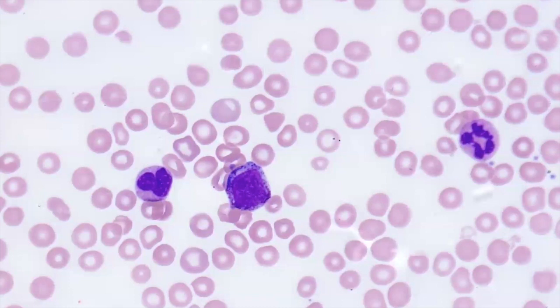On bone marrow biopsy, the finding of clusters or sheets of megakaryocytes with significant fibrosis and/or marked granulocytic dysplasia may be considered suggestive of an accelerated phase CML.